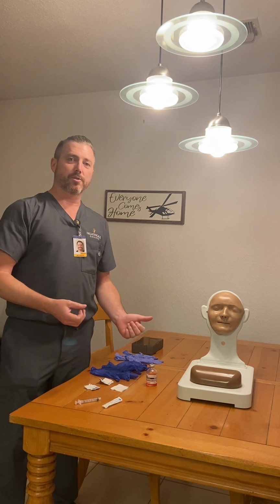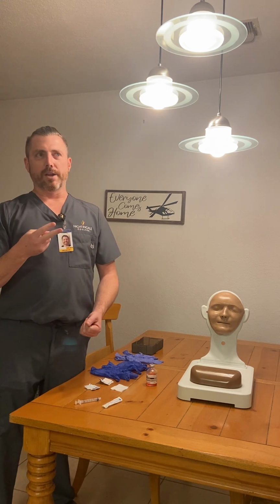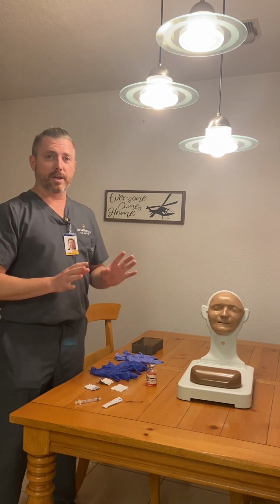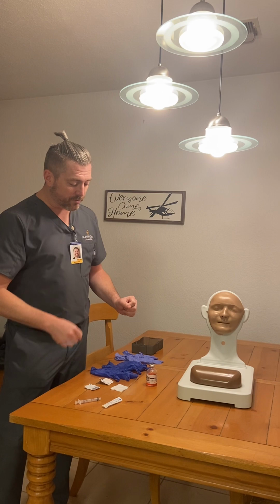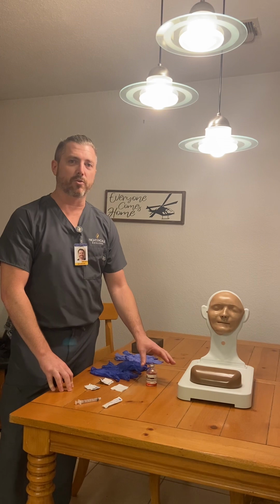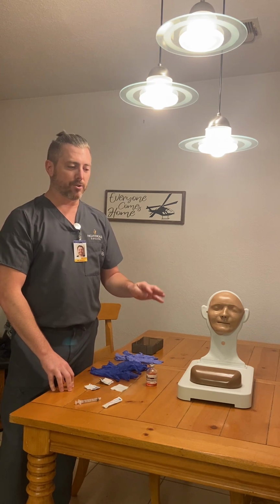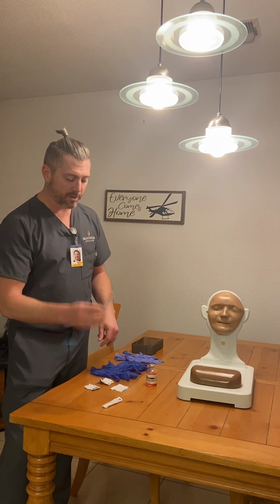So we'll go over our 6 patient rights of medication administration. Right patient, right medication, right dose, right route, right time, and right documentation. We want to verify with the doctor's order in the EHR that we have the correct dose. It's morphine sulfate, 4 milligrams per milliliter. The doctor has ordered 6 milligrams, so it's 1.5 milliliters that we're going to pull up in our syringe.